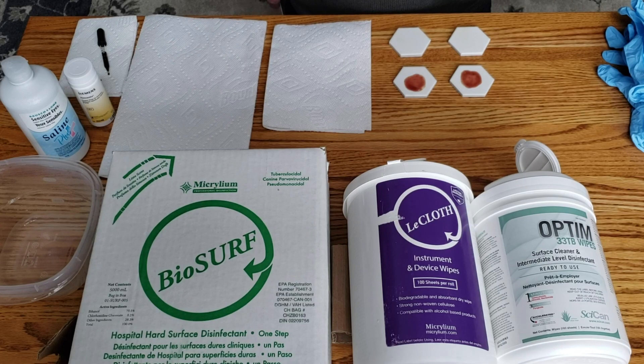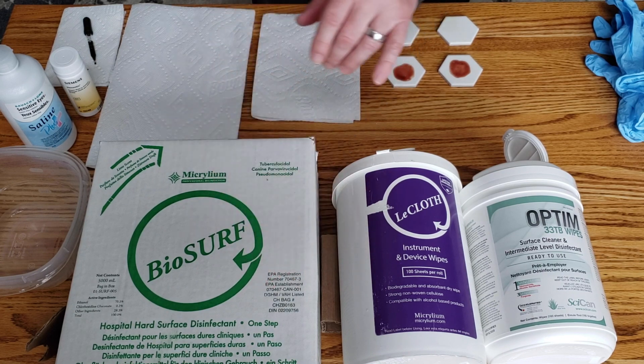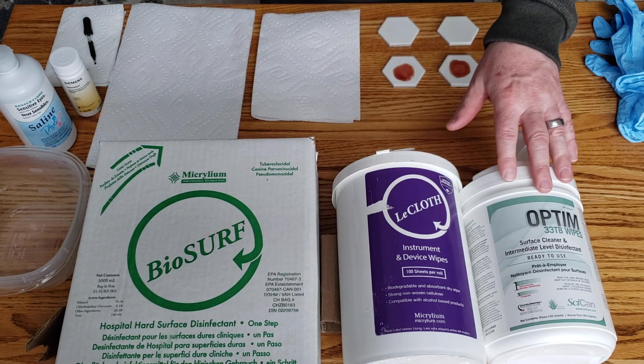Hi, I'm Ted Gray from SciCan. Today we're going to be doing a cleaning efficacy test comparing Micrylium BioSurf One-Step and their LeCloth wipes with Optum 33 TB ready to use.